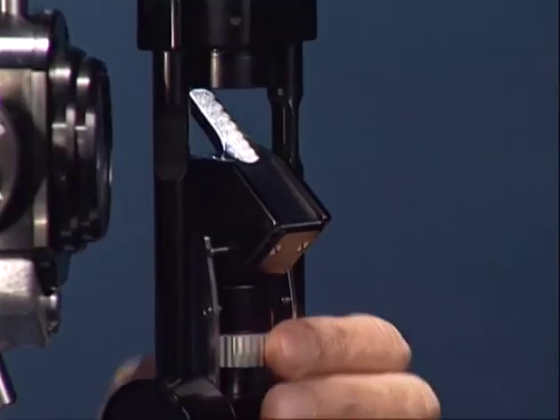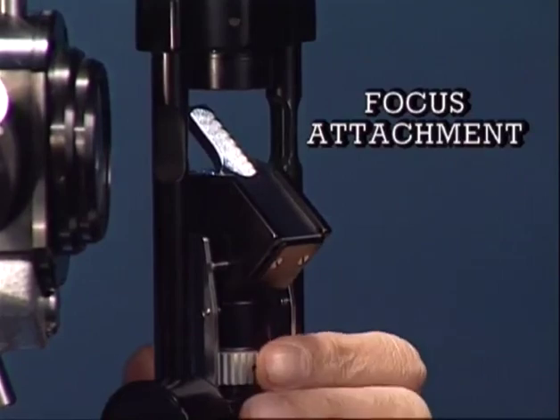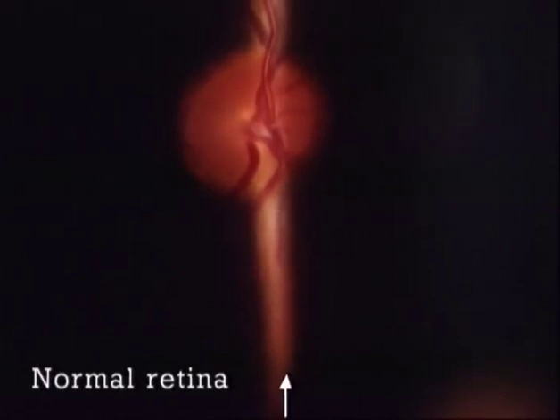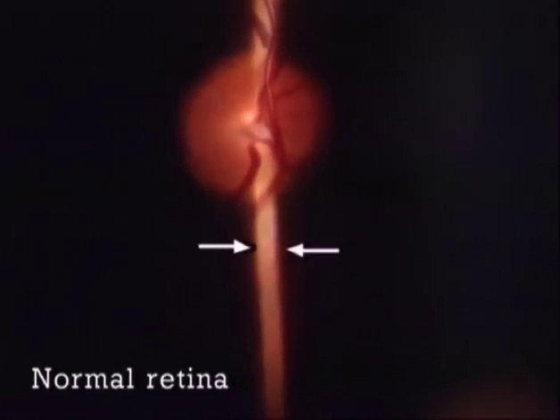For refocusing of the slit light, the slit lamp may be equipped with a special focus attachment. Its purpose is shown here at the fundus. The microscope has been adjusted so that the target appears sharp. Now the slit light is adjusted by the focus attachment until it also appears sharp, and this eventually allows the slit to be made narrow.